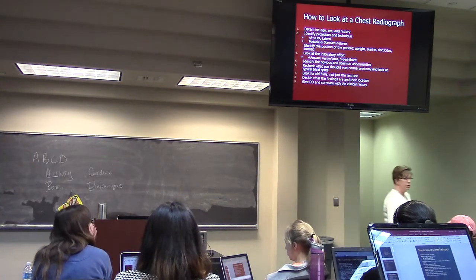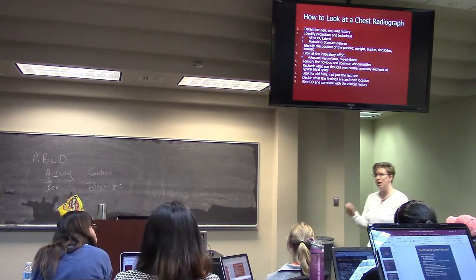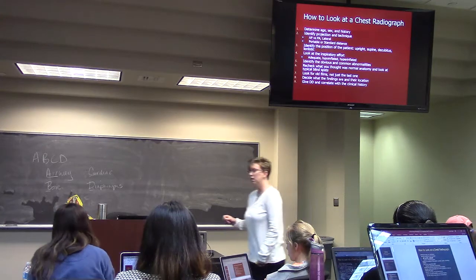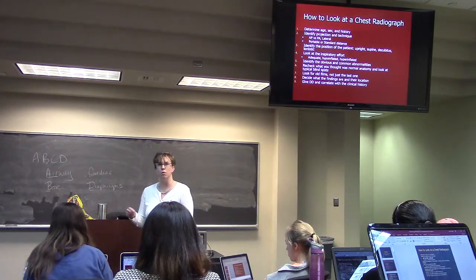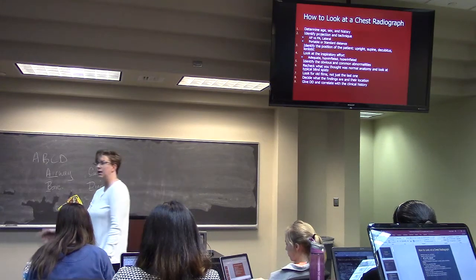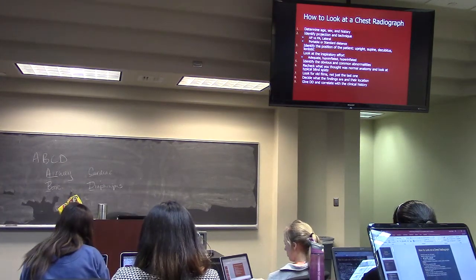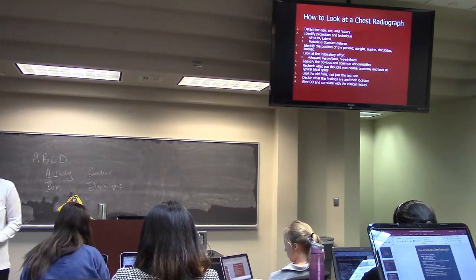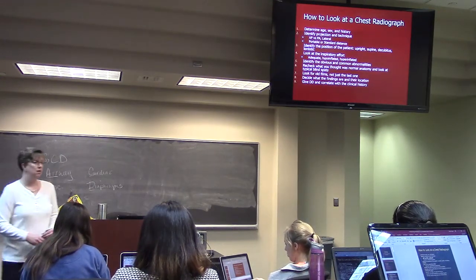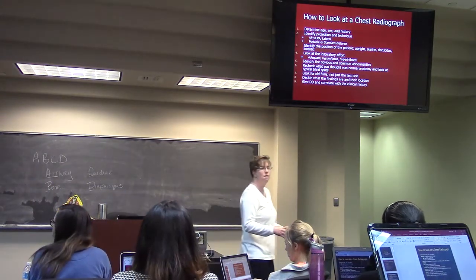And you never interpret an x-ray without a patient's history. Right? The patient's the most important. What they tell you and your physical exam helps lead you to a diagnosis. Can you find things incidentally? Absolutely. But our x-rays help us get to that diagnosis.